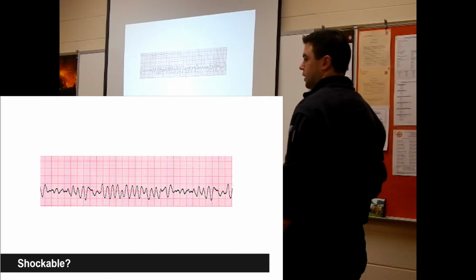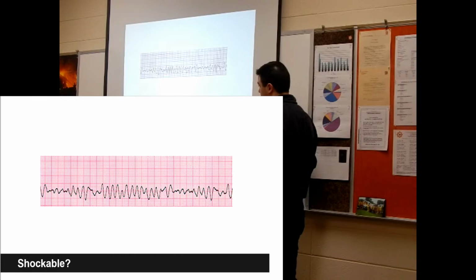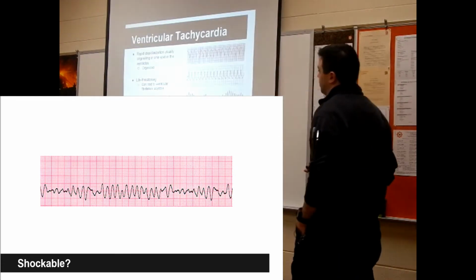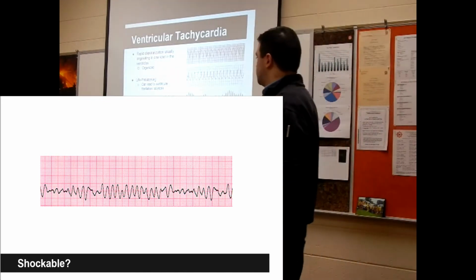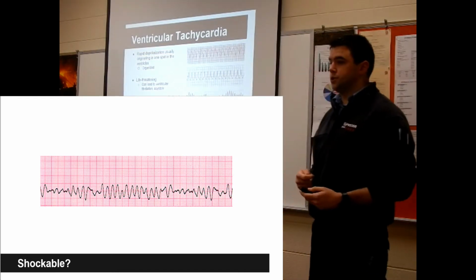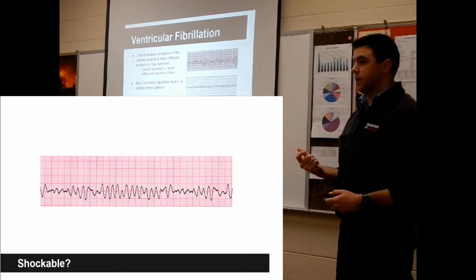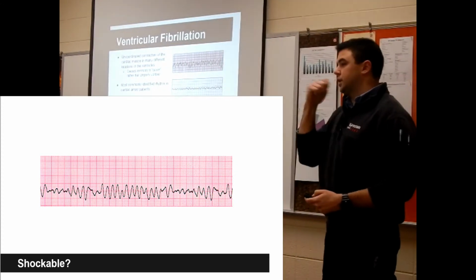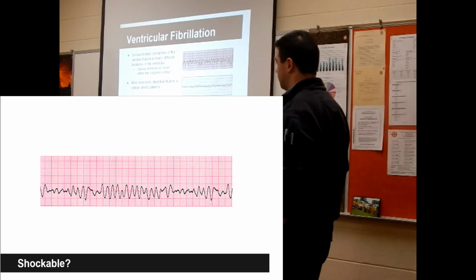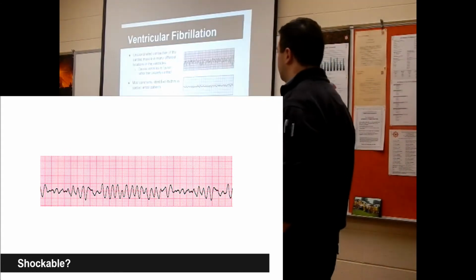Okay, does it look organized? It doesn't look very organized. It's kind of like a scramble. Through VTAC and Vfib, the easiest way that I found to remember it is something that I was taught in basic. VTAC is the old way you used to brush your teeth when you were a kid. It's just that straight up and down motion. And Vfib is the first time you ever tried one of those automatic toothbrushes and you put it in, it kind of skips all over the place. I don't know why, but that stuck with me. So if that helps you remember what kind of rhythm it is.